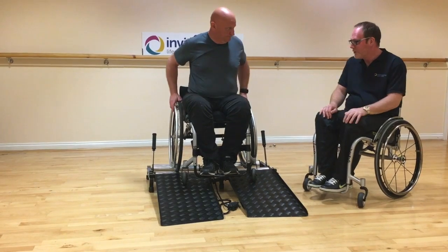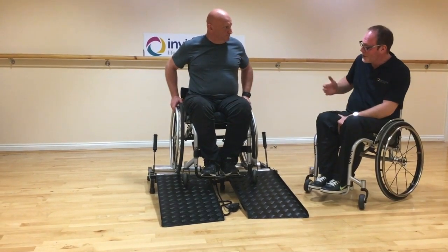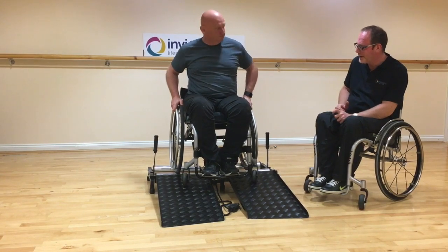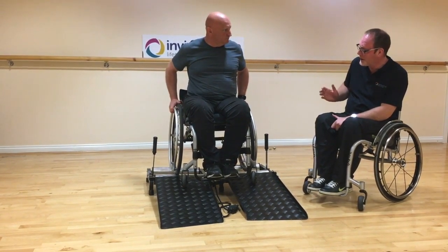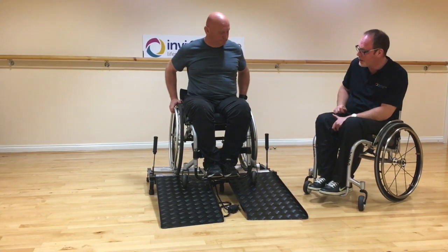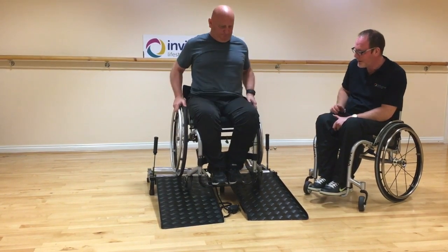Because you're coming off for the first time, wheel forward and you'll feel the rollers lock onto the brakes. Keep constant pressure on your wheels — push as if you're going down a small drop off a kerb — and just push forward.